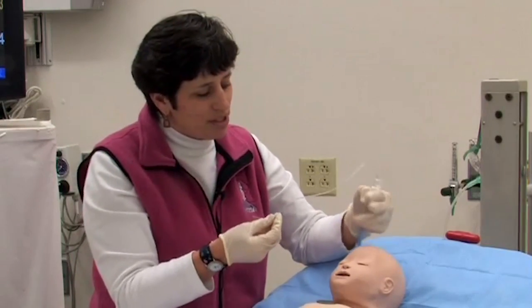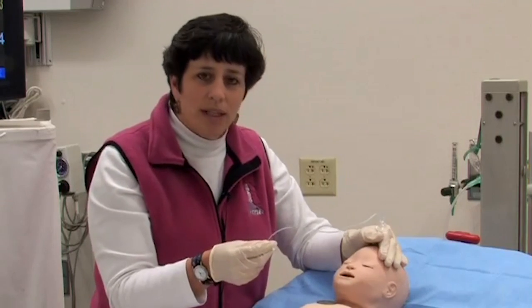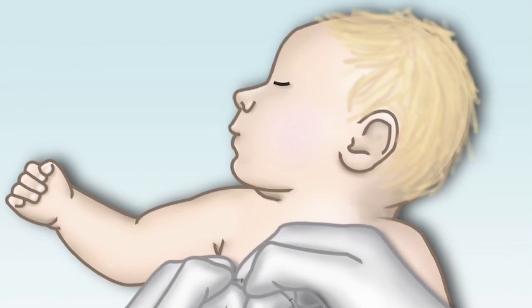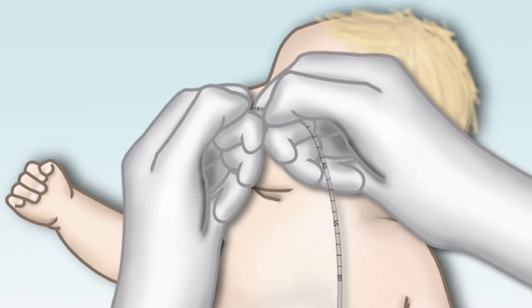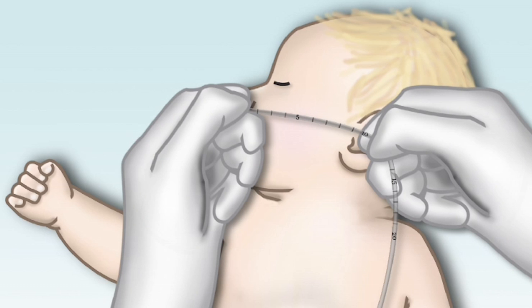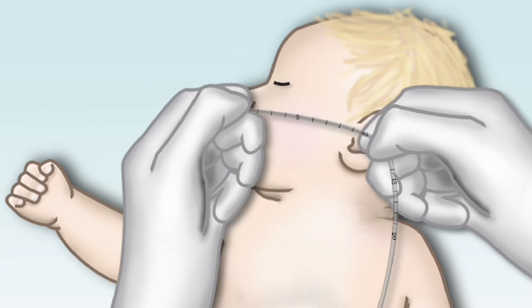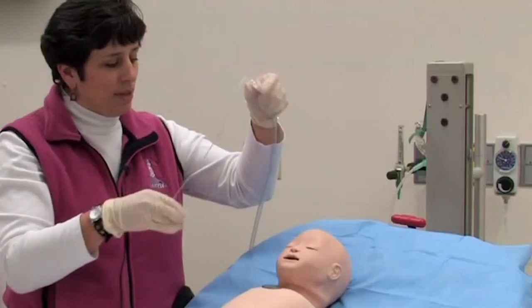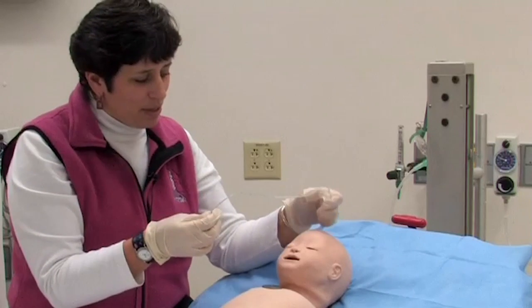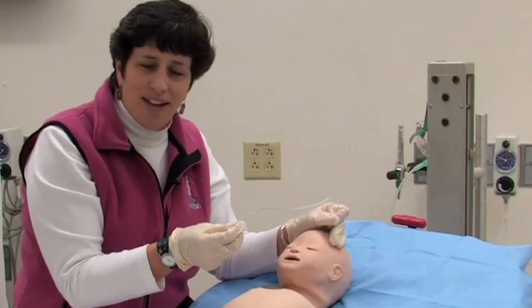I am going to hold on to this baby's head just so the baby doesn't wiggle away. Before I start, I am going to measure from the baby's nose to ear to get an approximation of how deep I am going to suction — that is about at the 10 mark. I will also prepare the parent as well as the child.